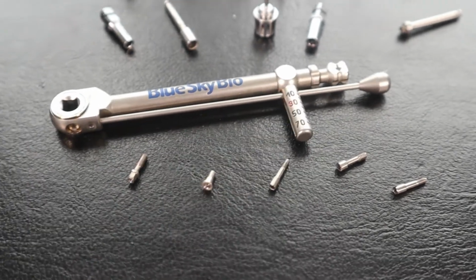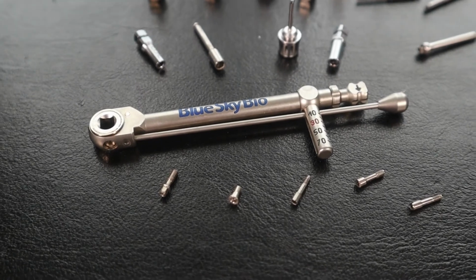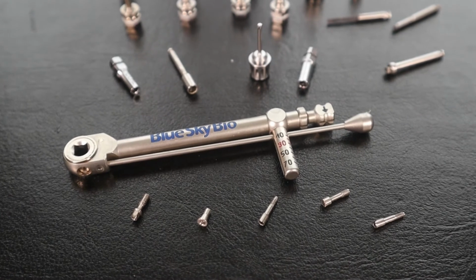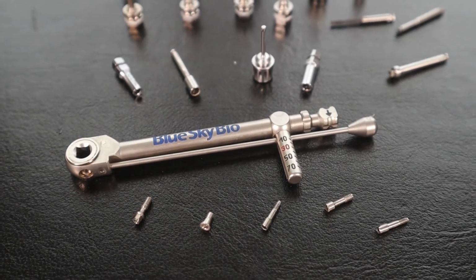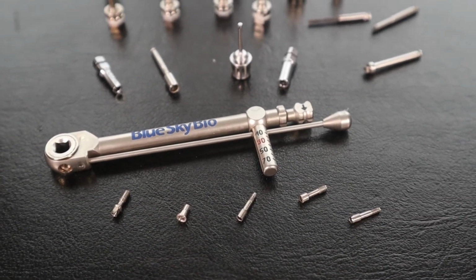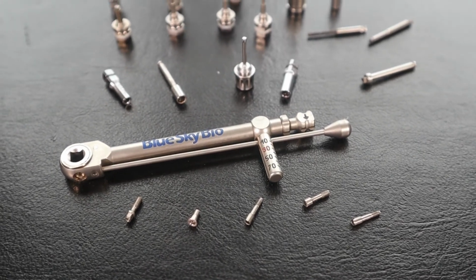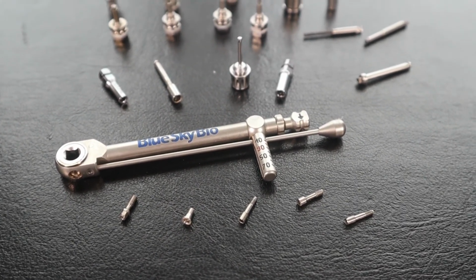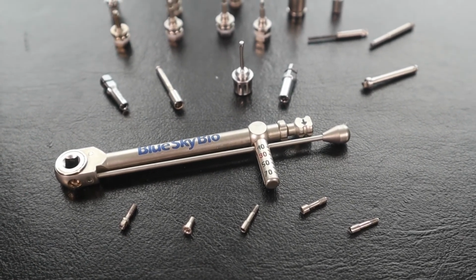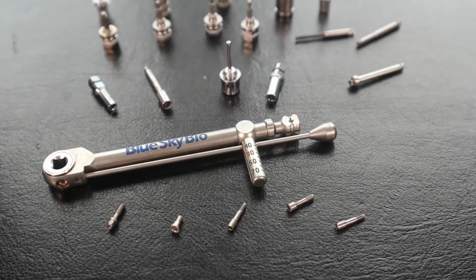To convert that to English units, 35 Newton centimeters converts to about 3.1 pound-inches of torque. To convert that into pound-feet of torque, which you will probably be more familiar with having worked on cars and whatnot, or even just tightening the lug nuts on your car, 35 Newton centimeters of torque is equivalent to 0.26 pound-feet of torque, so not very much.